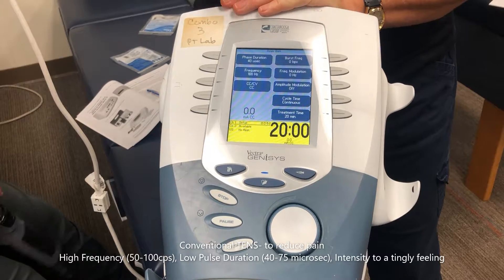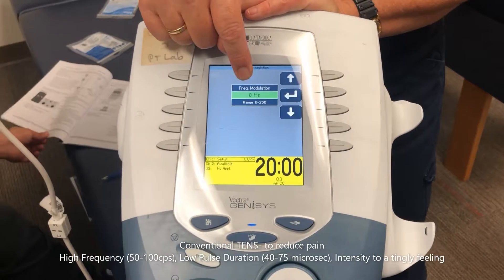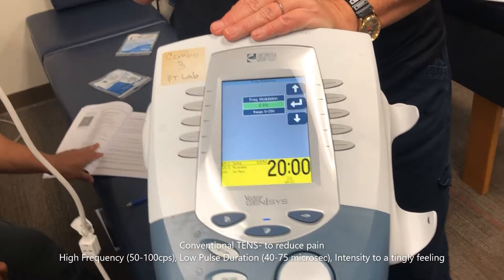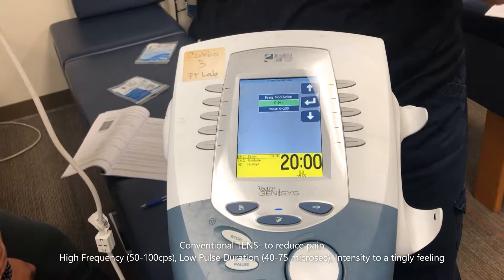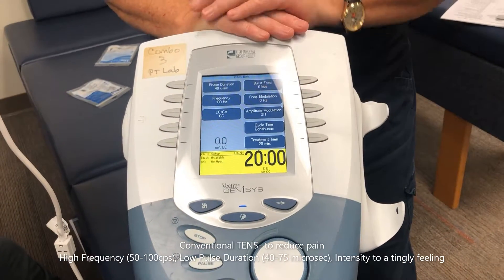What does frequency modulation mean? It changes within a frequency range. For example, if I set it to 80, I could have it go up 20 and down 20, keeping it within the 50 to 100 range — creating a sweep. I'm not going to use it here.